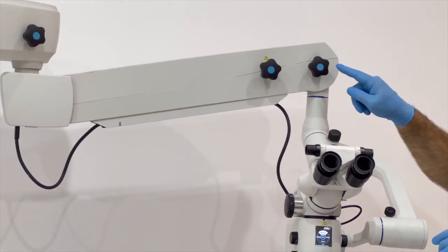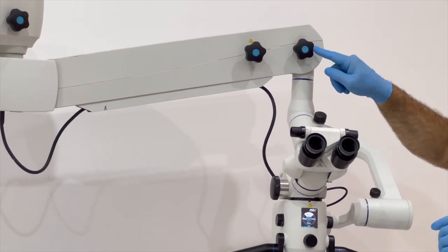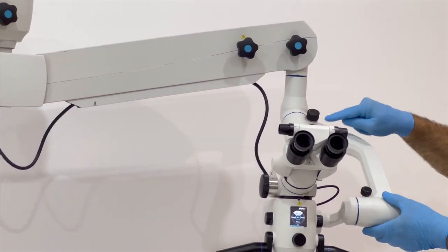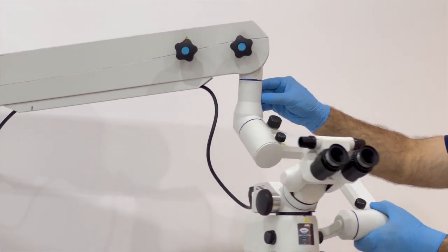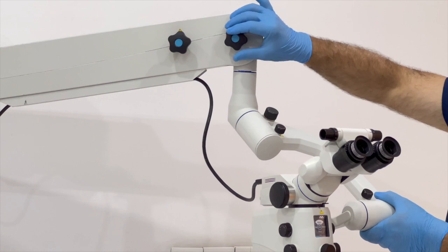Then the final screw in the arms is the screw which is responsible for the rotation of the balancing arm. This screw is responsible for that.